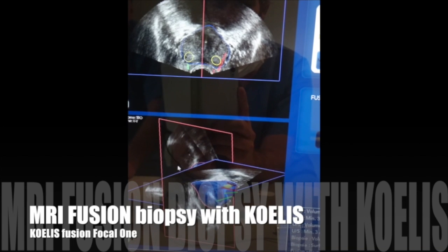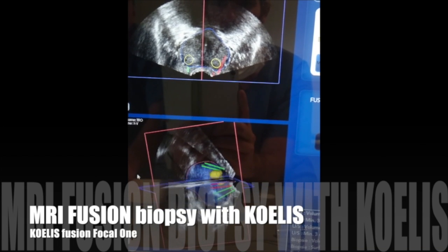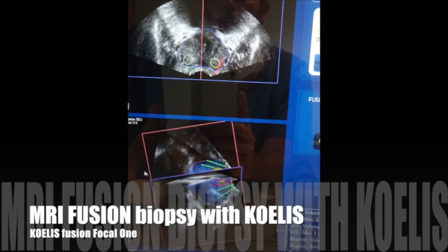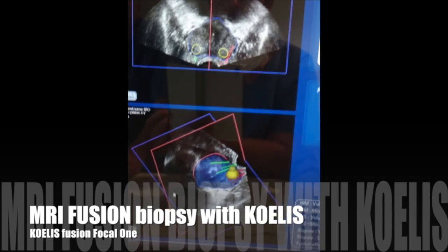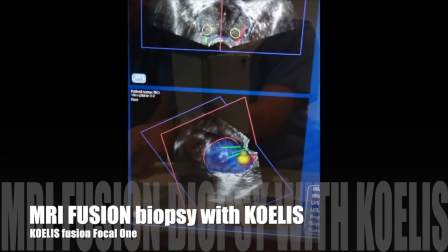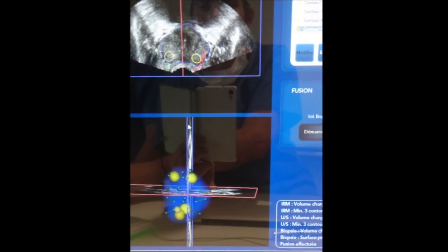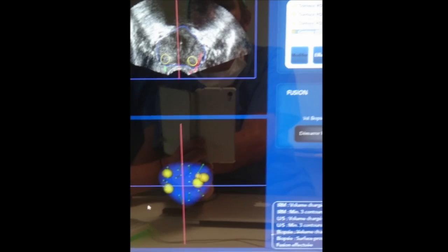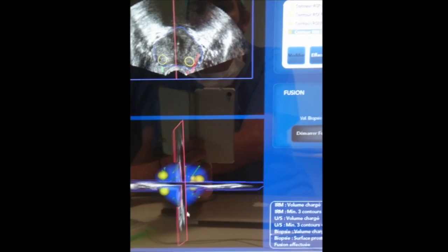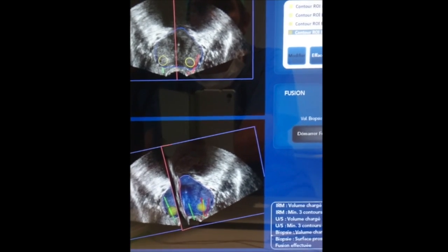You can also import target fusion biopsy realized with the soft Koelis, with all the mapping biopsy included: all the target in yellow, all the normal biopsy in green, and all the target biopsy in red.